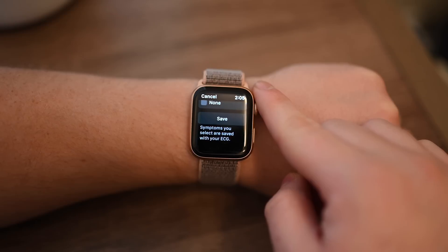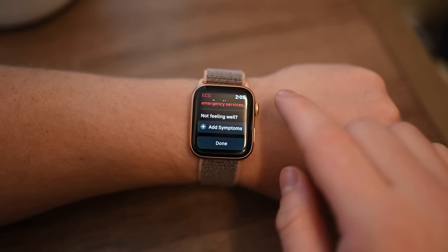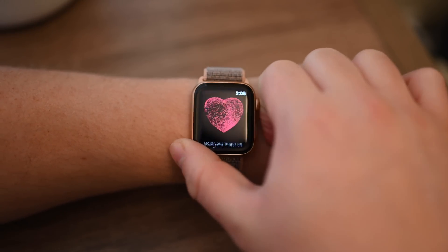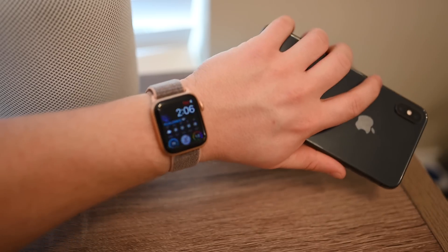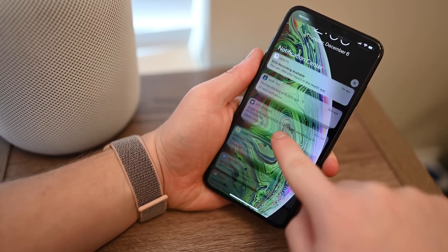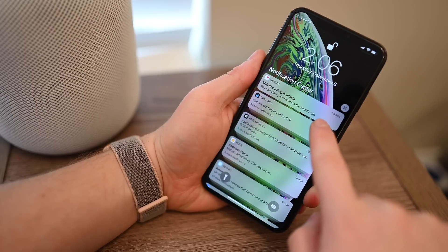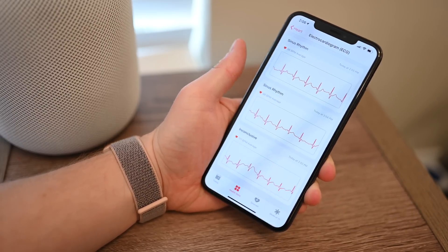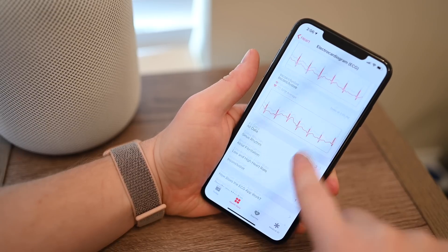According to the CDC, AFib can affect up to 2% of those under 65 and 9% of those above. So Apple is primarily trying to bring attention and awareness to those problems. Apple Watch doesn't show a lot of information on the watch itself, so anytime you take an ECG it'll show up on your iPhone within Notification Center. Tap on the card and you're brought into the Health app where you can view all of your data.